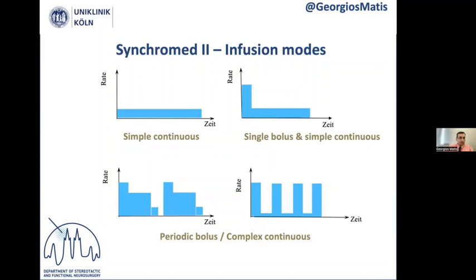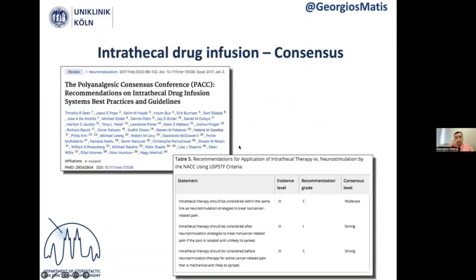With the gas pumps, we have only a simple continuous flow. With the programmable pumps, we can have a simple continuous flow or different combinations of both. This is particularly useful if we have patients with pain, let's say at night when they need much more drug. We can program the pump in such a way that the patient is getting more drug at night.